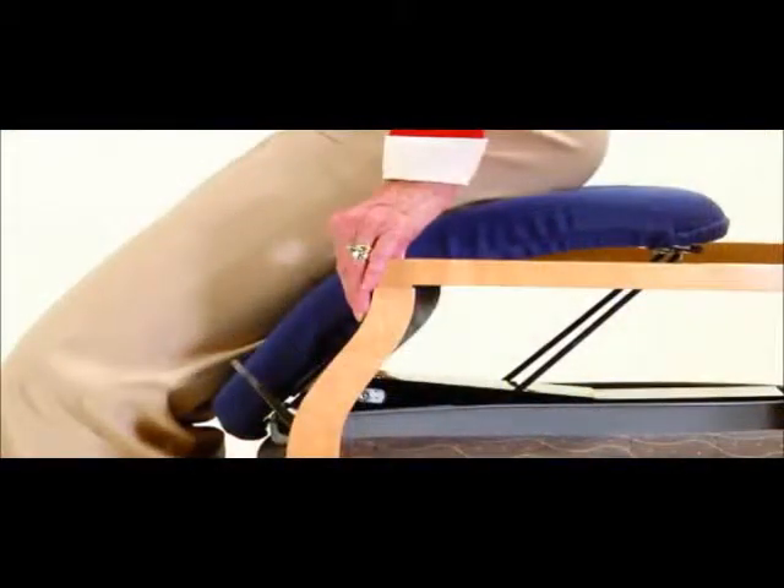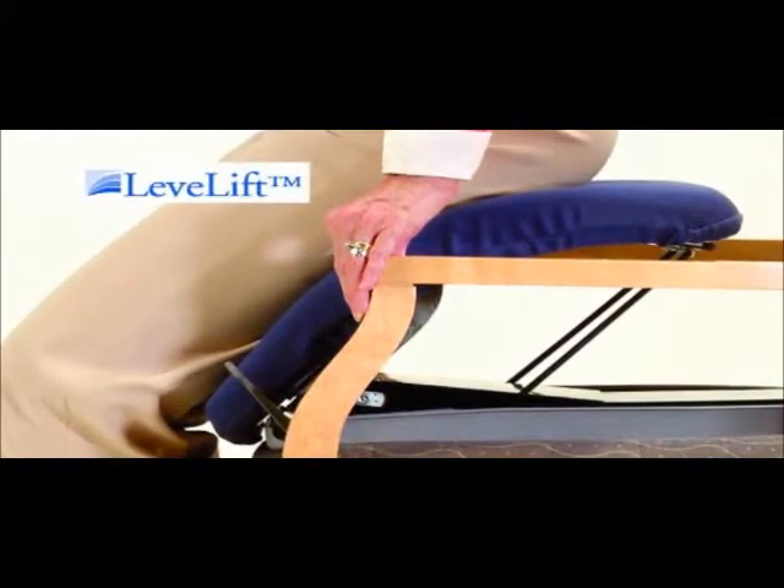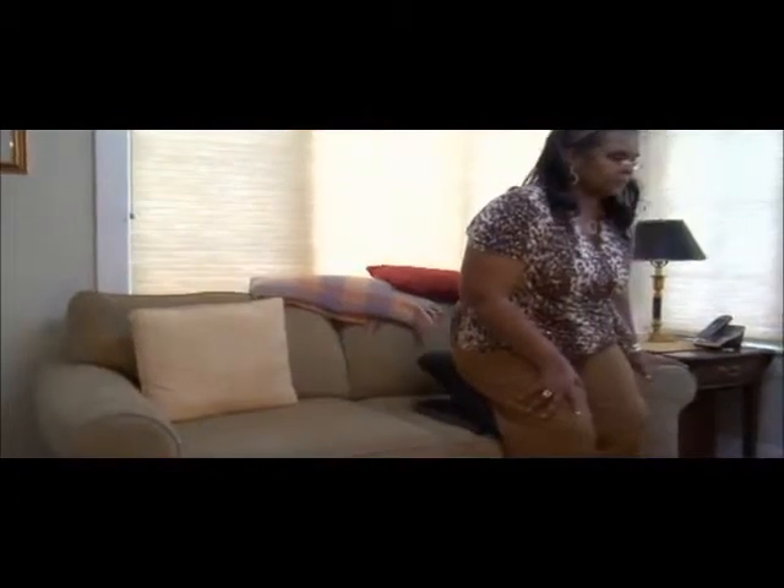Designed for comfort and safety, the PowerSeat features the patented Level Lift technology — a flexible seat designed to move up and down on a level plane.